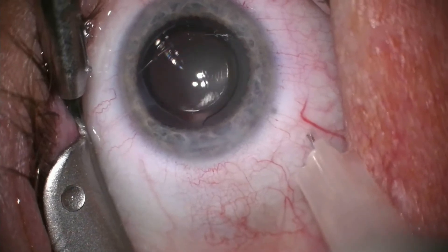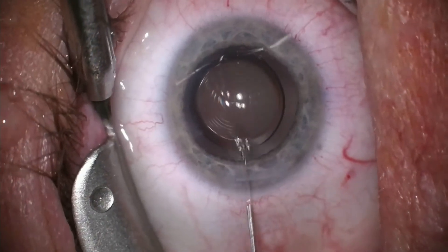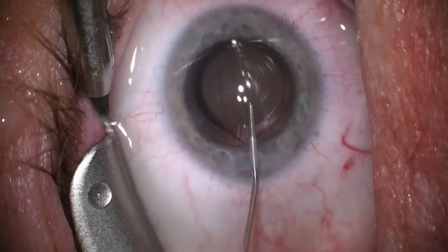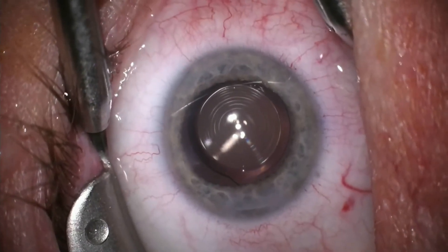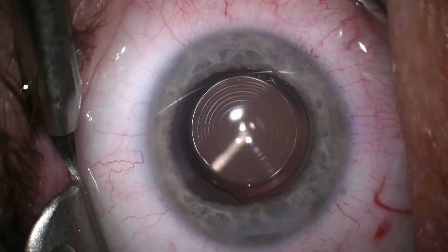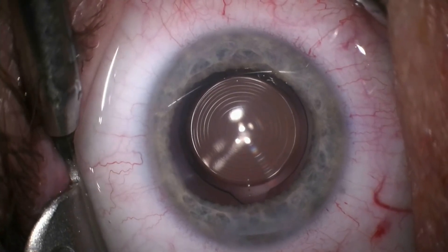Fluid is then inserted while checking the alignment and the centration of the implant. We can then zoom in and check the appearance of the lens implant, which appears to be well centered and appropriately aligned. The procedure is now complete and the patient will be spending about ten minutes in the recovery chair prior to going home.